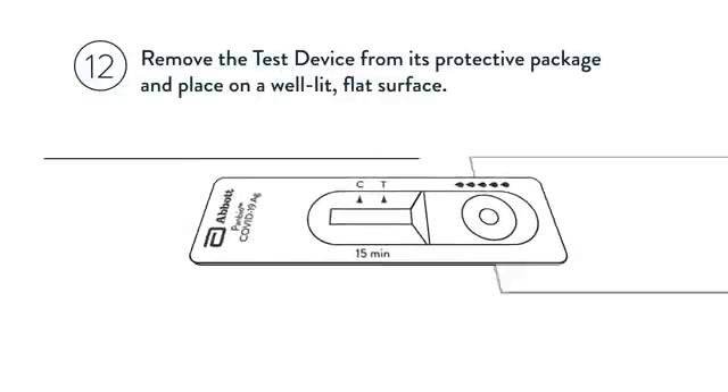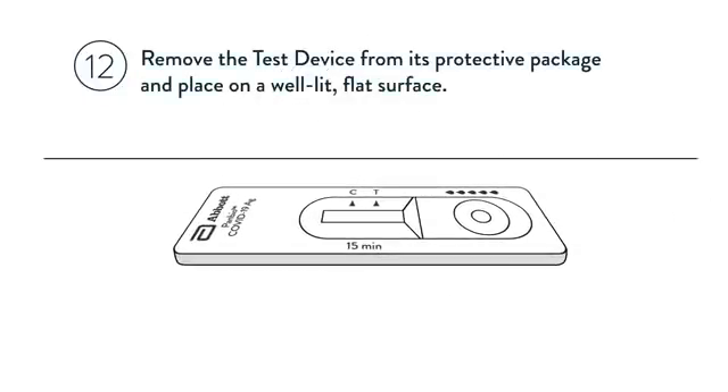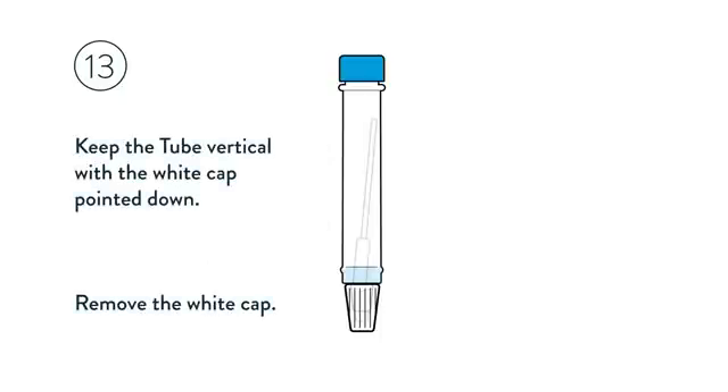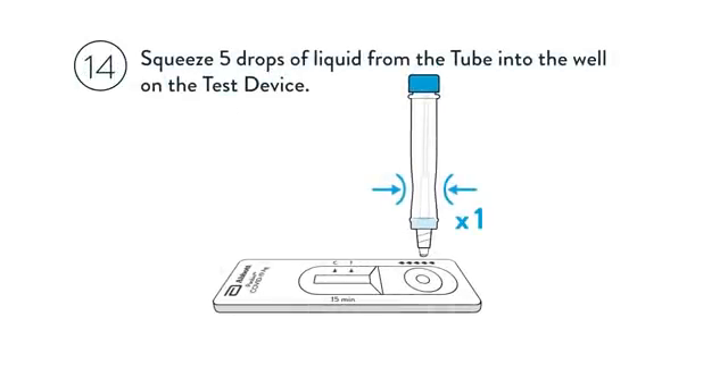Remove the test device from its protective package and place it on a well-lit flat surface. Check the liquid for bubbles and wait for any bubbles to disappear, as they can lead to inaccurate results. Keep the tube vertical with the white cap pointed down, then remove the white cap. Squeeze 5 drops of liquid from the tube into the well on the test device.